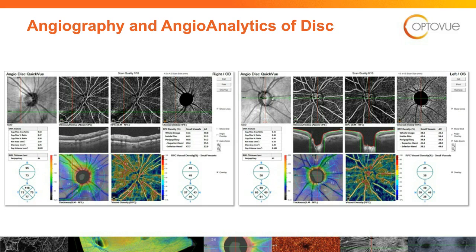Let's go over and take a look at the left eye. The nerve fiber layer is more compromised here, superior and inferior. You can see that there's less tie-dye. You can see the numbers over here, how that's helping us out. But let's go over to the radial peripapillary vessel density, and we can see 41 and 36.